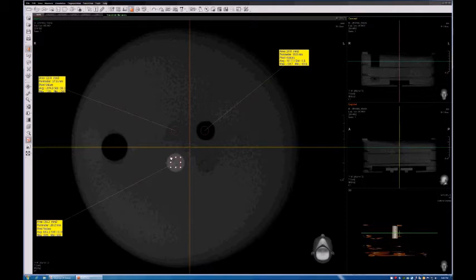Okay, and that's pretty much it for the CT number evaluation. Just make sure that your average values for the three materials are, as I said, 1000 Hounsfield units plus minus 200 for Teflon, 0 Hounsfield units plus minus 200 for water, and minus 1000 Hounsfield units plus minus 200 for air. Okay, those are the tolerance ranges.